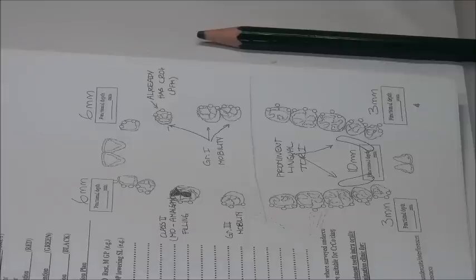I could place rests, yes I can. I could place my guide plate, yes I can. So grade 2, that's the border area. I cannot clasp it. I cannot rest it. But I can put guide plates on it. Okay? This is grade 2.